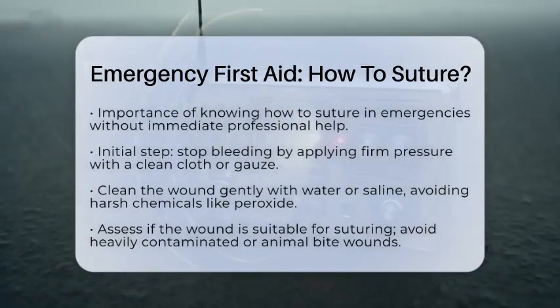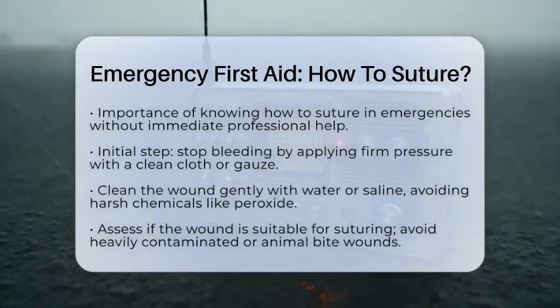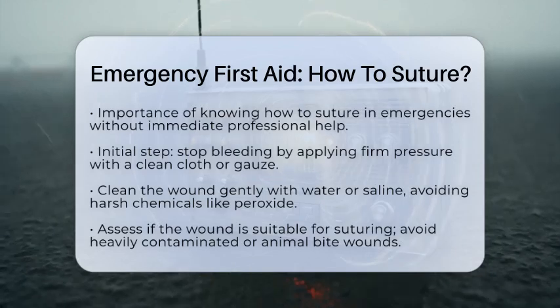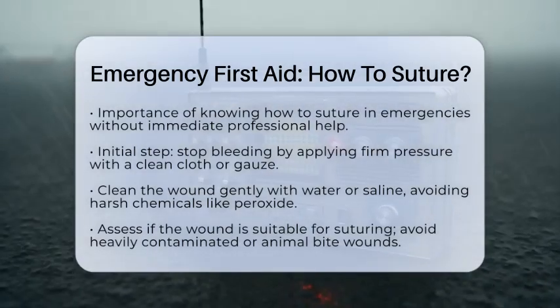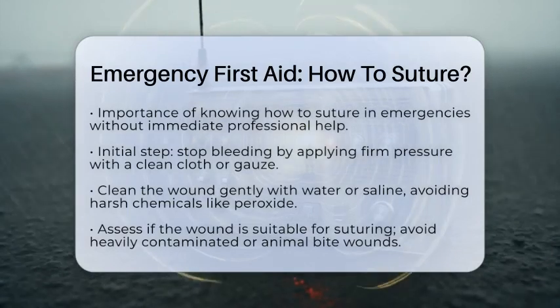But suturing isn't something to take lightly. It requires careful preparation and a steady hand. First, you need to stop the bleeding by pressing firmly on the wound with a clean cloth or gauze. Once the bleeding slows down, gently clean the wound with clean water or saline solution to remove dirt and debris. Avoid harsh chemicals like peroxide or iodine because they can damage tissue.